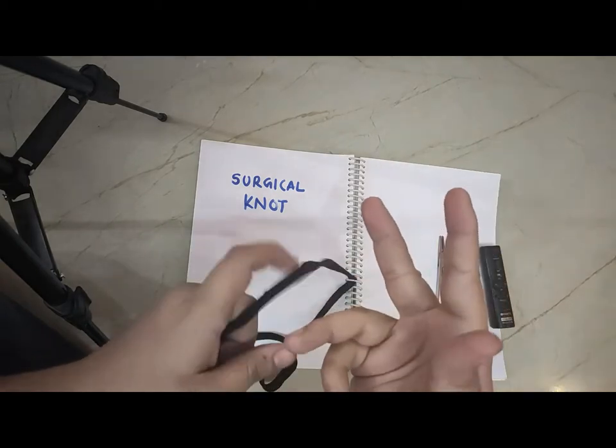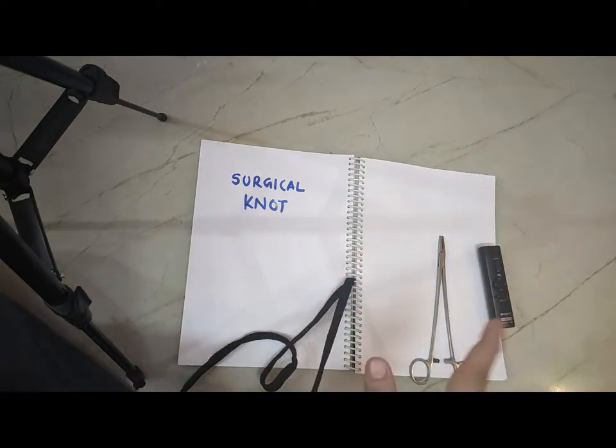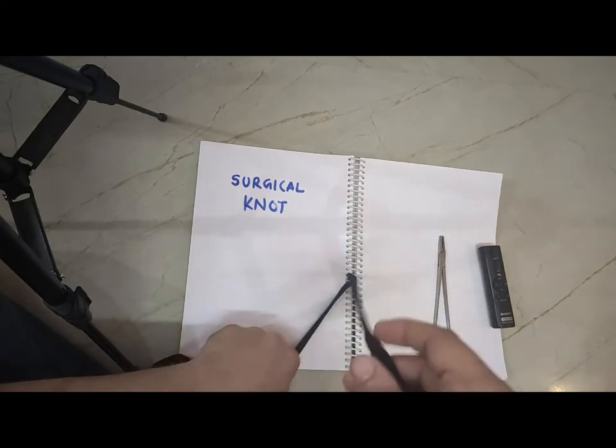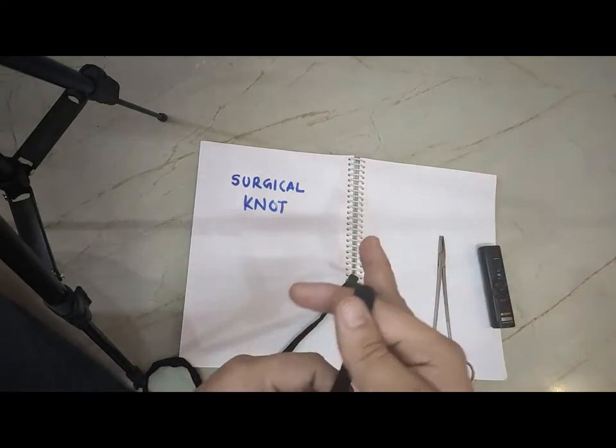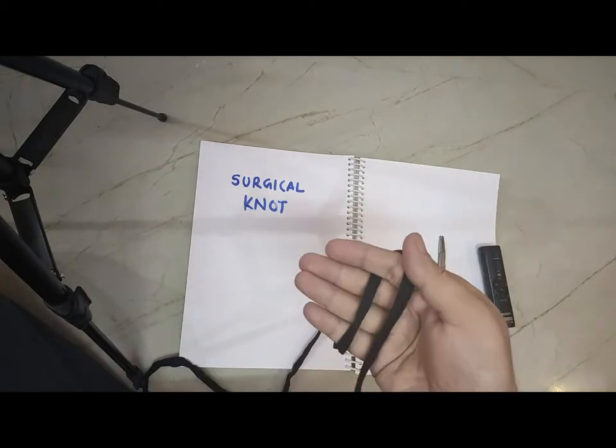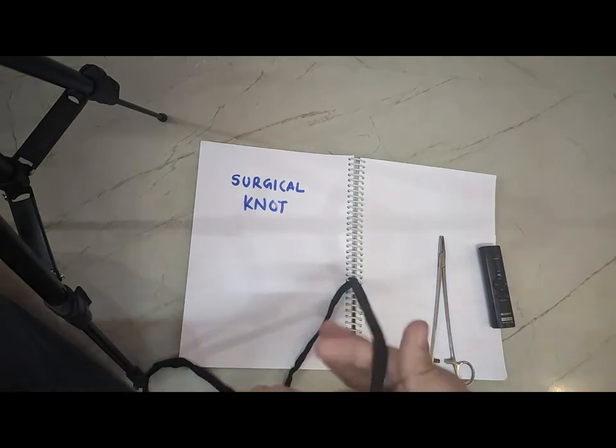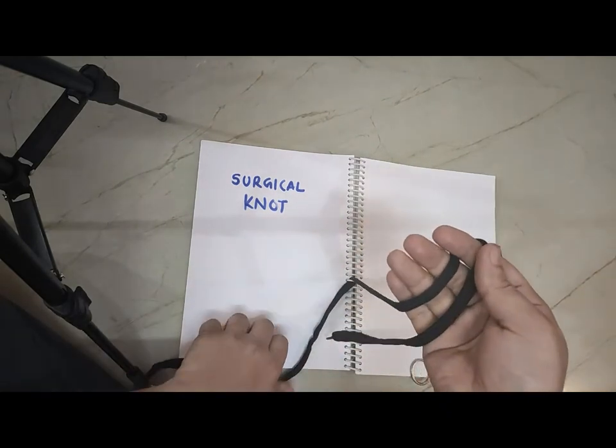The middle finger will be the main thing to act in this knot. The one end we catch like this. Now the other end is going to be placed like this.